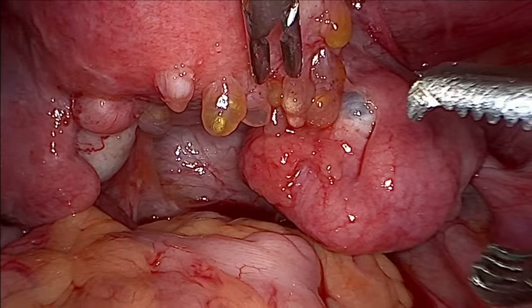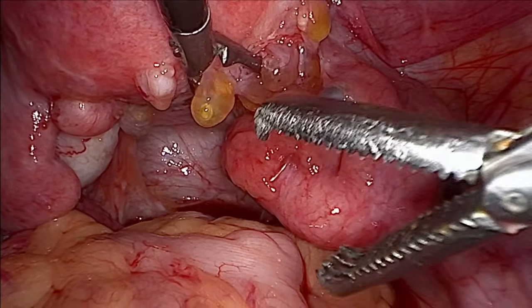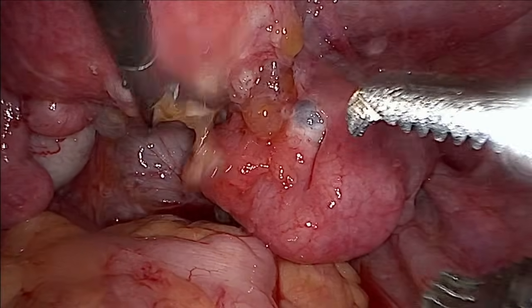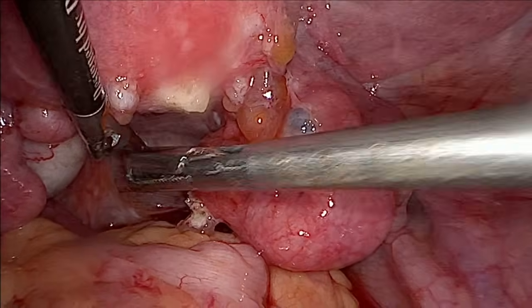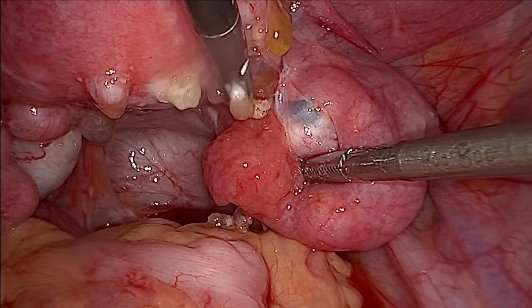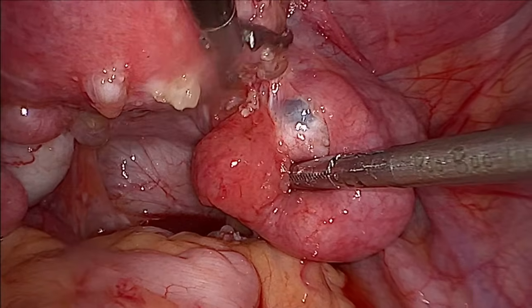You can see this superficial endometriosis here. These are all superficial vesicles. You can just excise this, or you can just burn this off, it does not matter. But this vesicle suggests that it's quite an active disease.